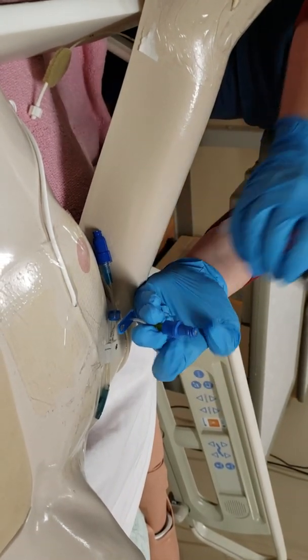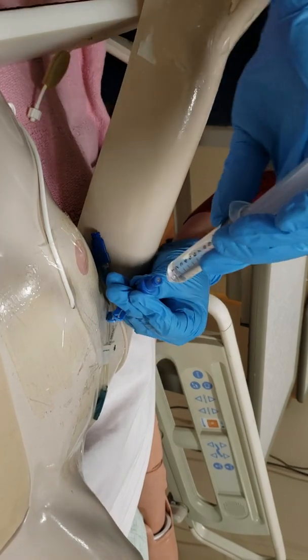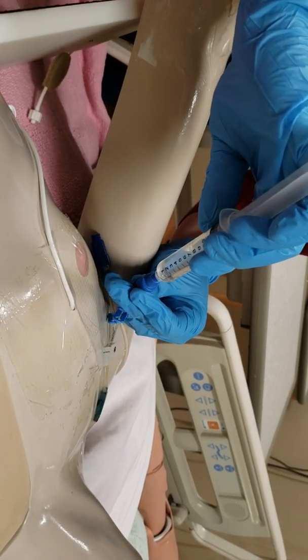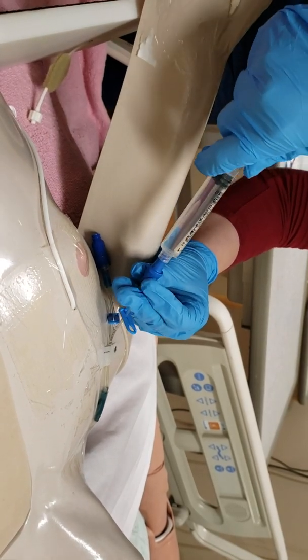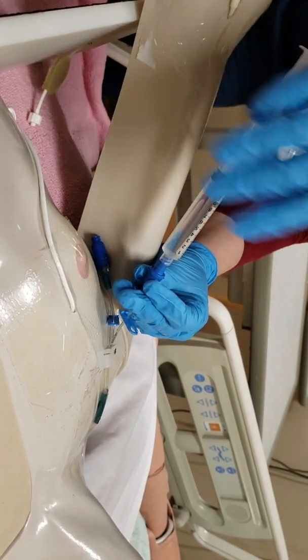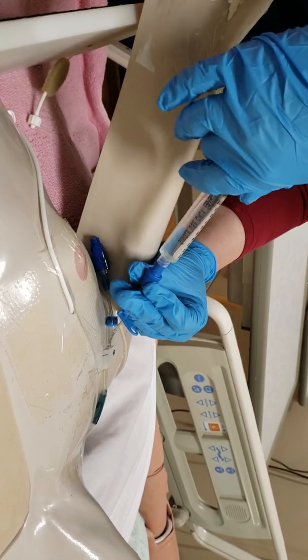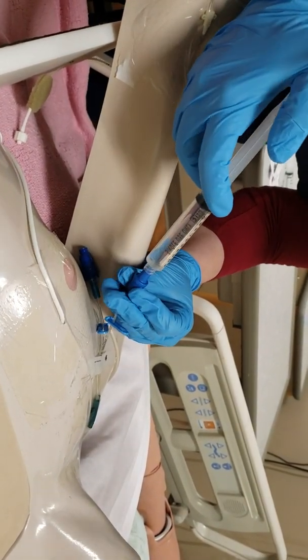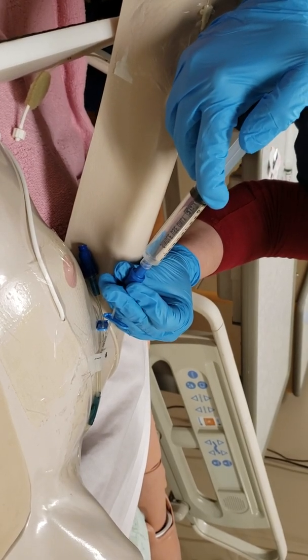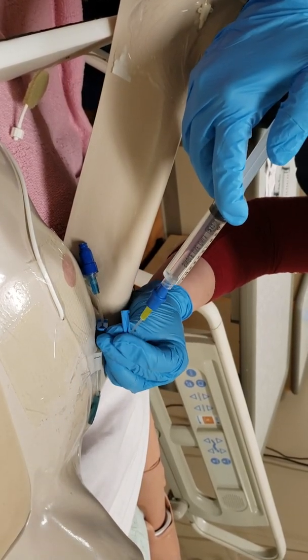Now I'm holding it this way so I do not recontaminate my central line port. Just screw this on. What was not shown was that the air was eliminated from my 10 ml syringe. Oh, and I need to unclamp this.